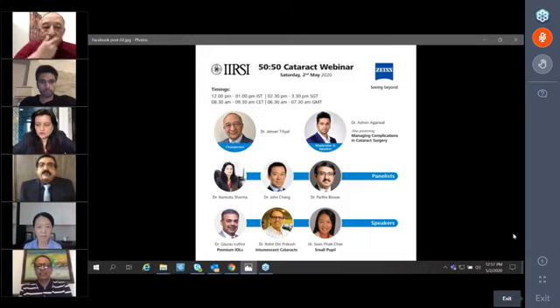With the OVD, if the shallowness is good enough and can be improved, then the rings can definitely go in. The rings actually take up space, as Professor Chee also said. If the viscoelastic has not been able to deepen the chamber to a proper limit, then the hooks are again the best to be used.